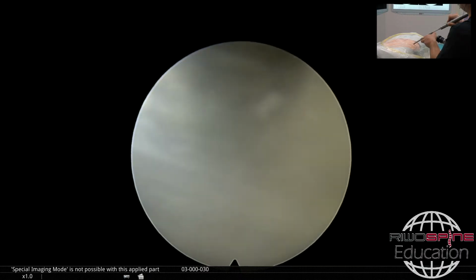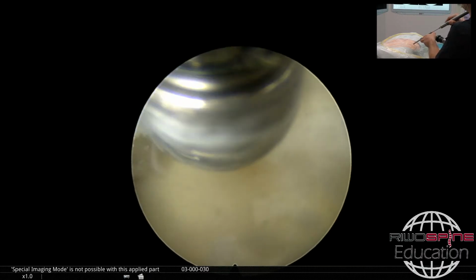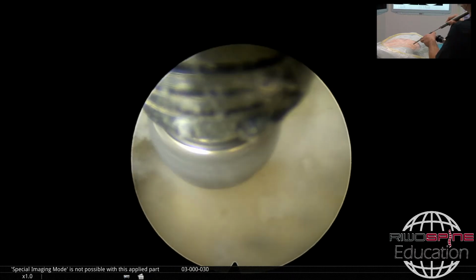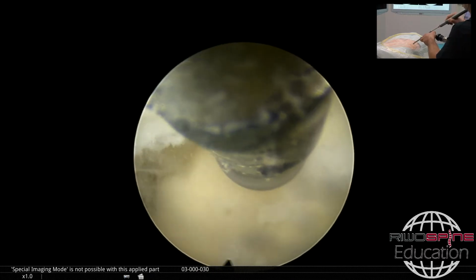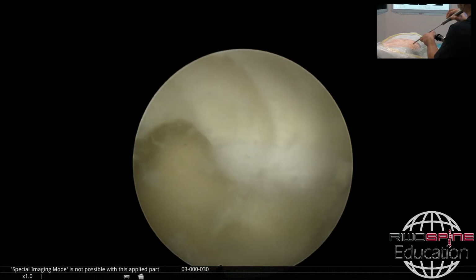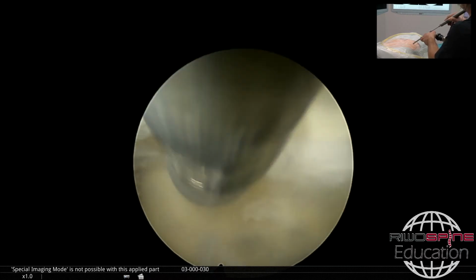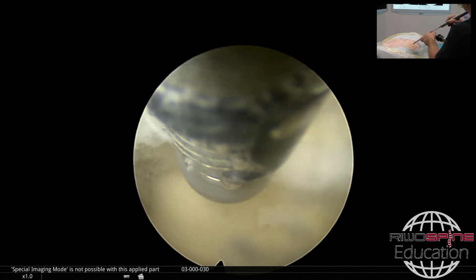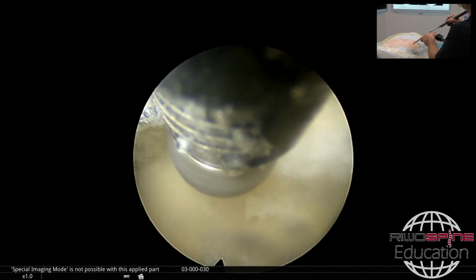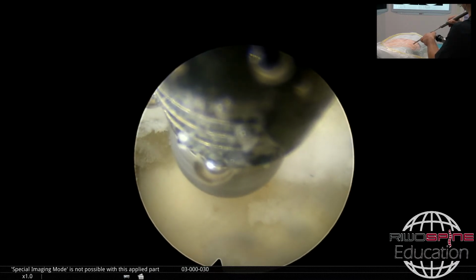So is your target now to resect all the bone required, or to leave something? Usually we prefer to do that to get better access to the spinal canal. If you can resect a little bit of the anterior part of the facet joint, then it's enough. Of course, there are a lot of discussions in the literature about whether you can do the recess decompression this way.